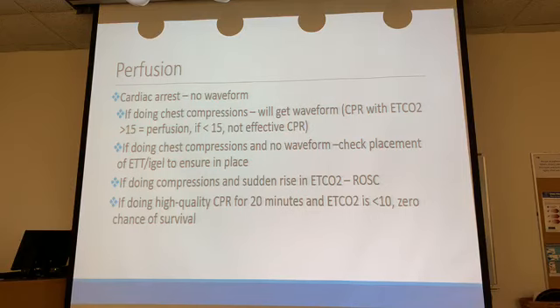If you're doing compressions and then all of a sudden you have an end-tidal CO2 of 20 and then it shoots up to 30, 40, you got ROSC back, okay? Because what happens when you get perfusion? You have end-tidal CO2. So you'll see it jump up, and you'll oftentimes see the end-tidal CO2 jump up before you'll even feel a pulse. So keep that in mind.